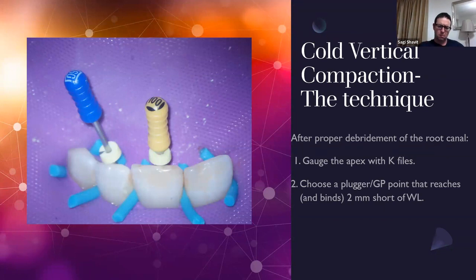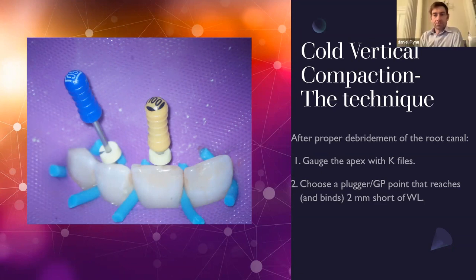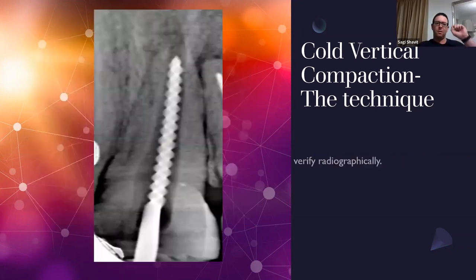Make sense so far? Yep. Yep, good. Now, everything that I said, we verify radiographically, and this is the case that I wanted to show you. Clearly, there is space between the canal walls and the file. I'm pretty sure it's just friction or resistance, the rigidness of the file not going through. I'm pretty sure that the apex is bigger than 100, but the 100 went to working length.